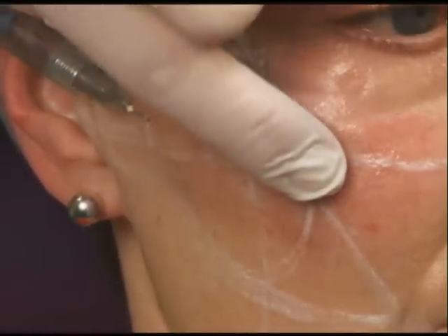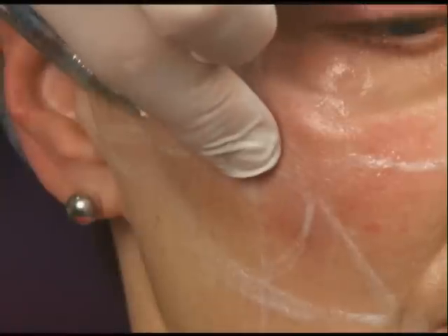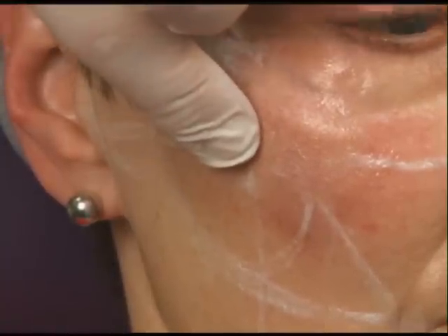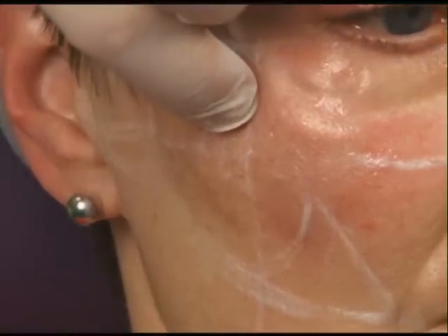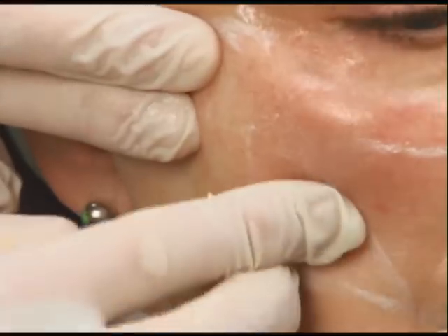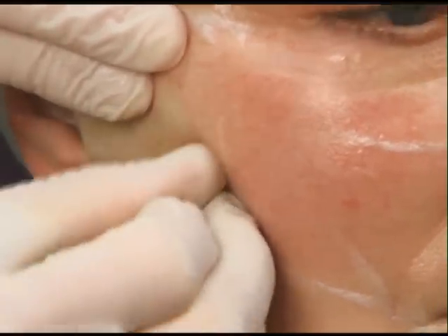Sometimes with a one-and-a-half-inch needle, it is a little bit harder to know what depth you're at. So it's more of an advance-withdraw and then redirect. As long as you're subdermal it's very easy to mold. It can look a little bumpy if you're not subdermal, but most of the time you can press those little bumps back down into the lower level and it'll look smooth.